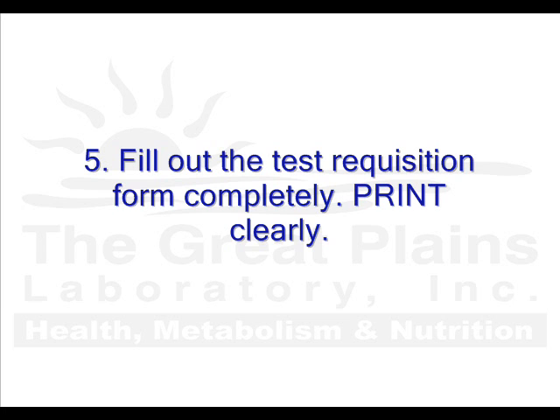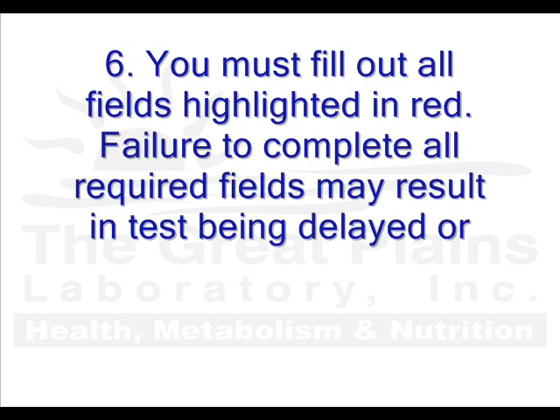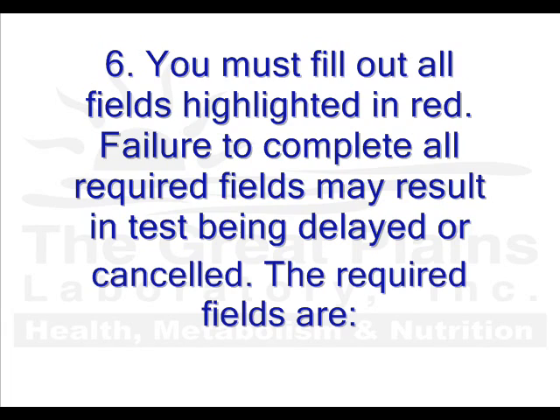Fill out the test requisition form completely. Print clearly. You must complete all fields highlighted in red on the test requisition form. Failure to complete all required fields may result in your test being delayed or in some cases canceled.